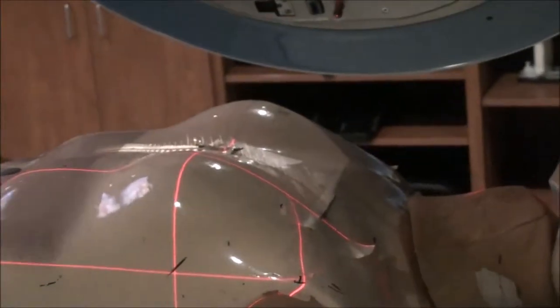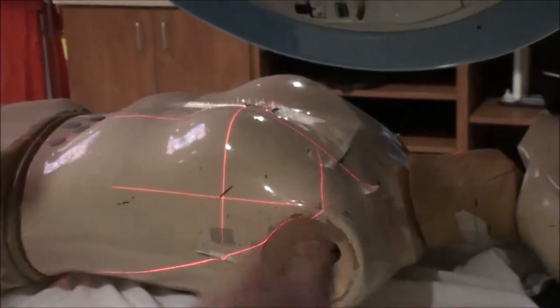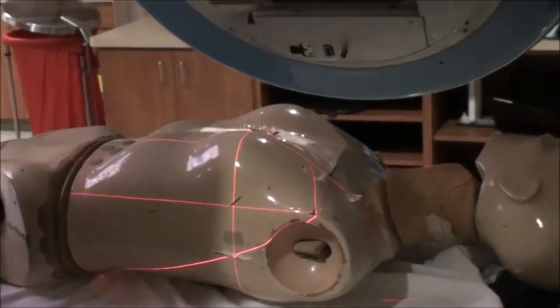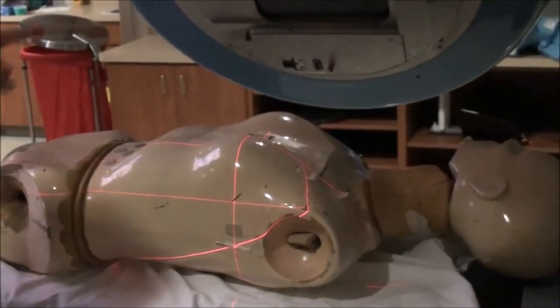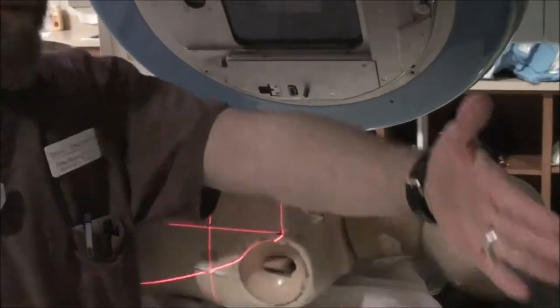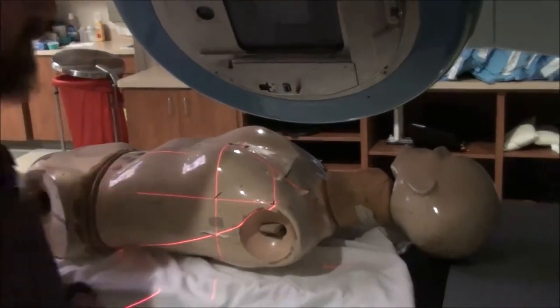I'm going to ballpark it up there. Once you kind of get to this point, take your separation. You need to have this mid-plane. Calculate your setup. Decide what your SSD is supposed to be, and stair-step your way up to it, just like before. Now the big difference is: at the superior end of this field, you've got a diverging beam — it's diverging up towards the gantry from the CR. We've got a flat angle of incidence here that we have to match, so we're going to kick the table.